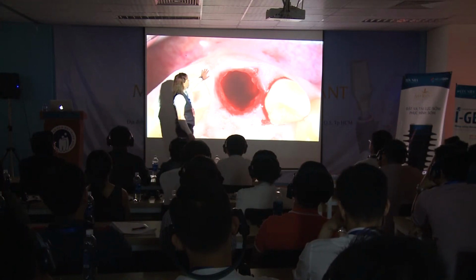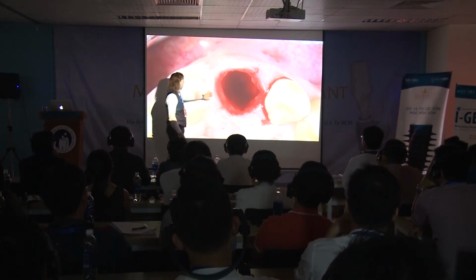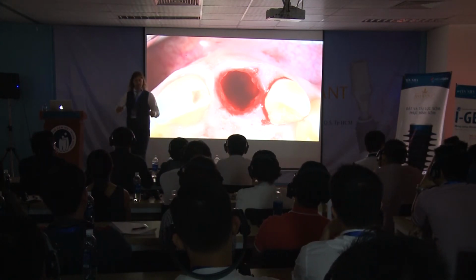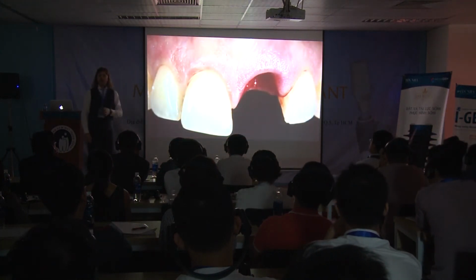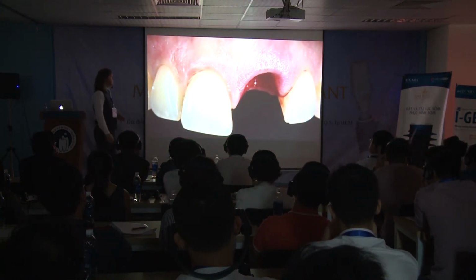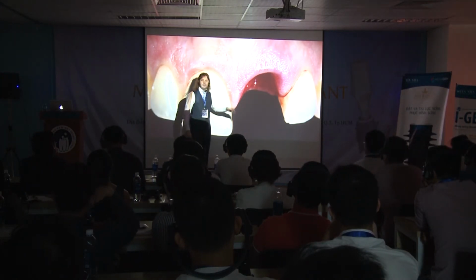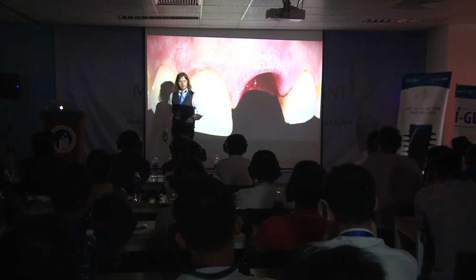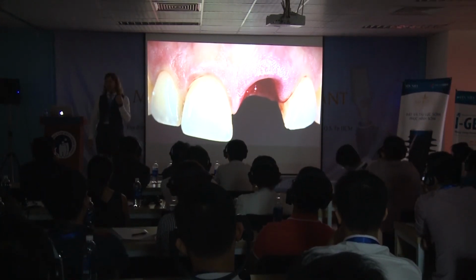We preserve very well the volume all around. You see, papilla are correct. They are not destroyed by my levers. It's very difficult to do an atraumatic extraction. It takes me half an hour to do an atraumatic extraction, and 1 minute to place an implant.